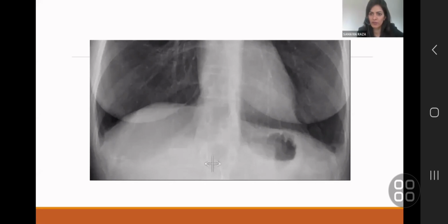CT has clearly superseded any other view you can do on a chest X-ray. The apical view, the decubitus view, the lateral view, all those fancy things we have learned very painfully in our training have now become obsolete. Part of the reason is chest CT is now so low dose. There are low dose CTs, there are ultra low dose CTs. There's barely more than a few X-rays, isn't it? So there is no point. It's not worth the hassle, and although smaller, there is still a risk of missing pathology on plain radiograph. So no.